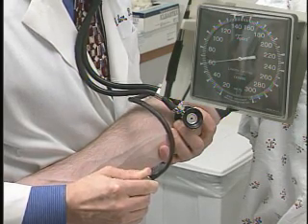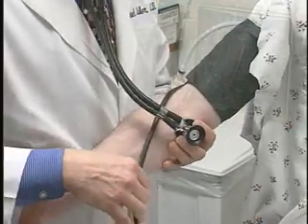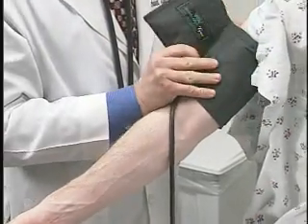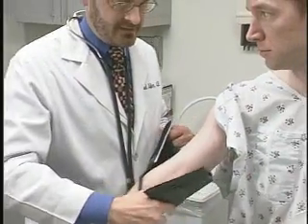The point at which I first heard the blood pressure pulse return was 116. I heard the pulse disappear at approximately 76. So the blood pressure by auscultation is 116 over 76. And of course I'm going to repeat this in the other arm, both by palpation and also by auscultation.